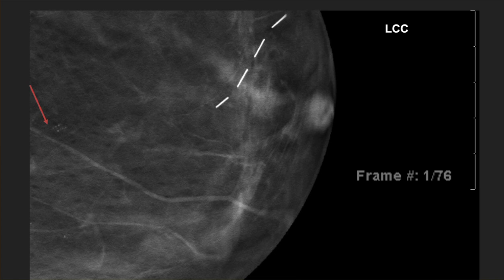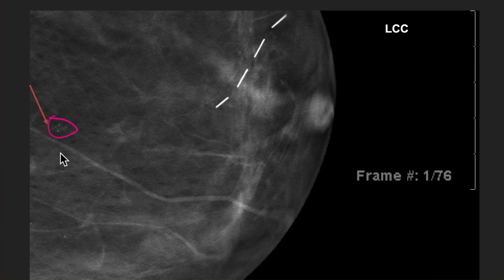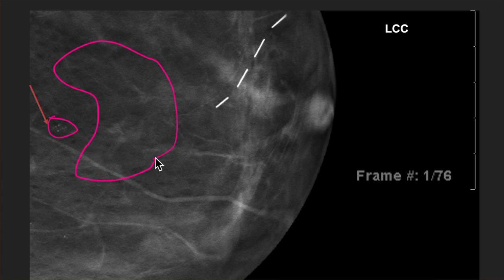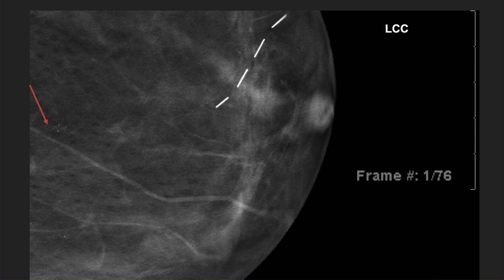Tomosynthesis has given us a great tool because most times we can tell the calcifications are in the skin because they're in either the first few frames or the last few frames — in other words, in the part of the breast compressed against either the paddle or the image receptor. Here's an example of calcs with a nice little grouping of pretty round calcs. You can see they are typically within what I call a "chicken skin" type appearance, which is classic of the dermis as it's compressed. And here they're on frame one of 76 — so these are skin calcs.